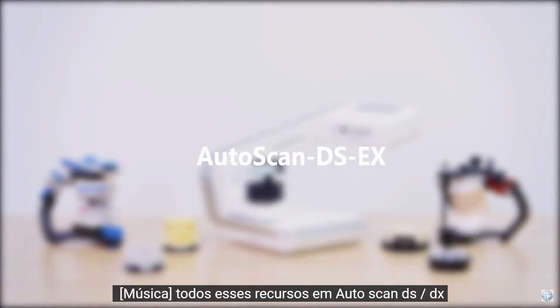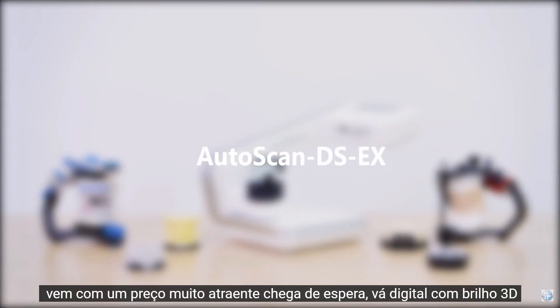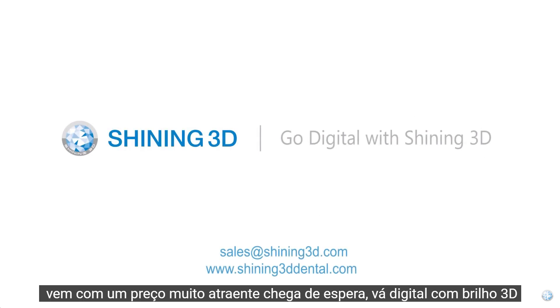All these features in Autoscan DS-EX come at a very appealing price. No more waiting — go digital with Shining 3D.